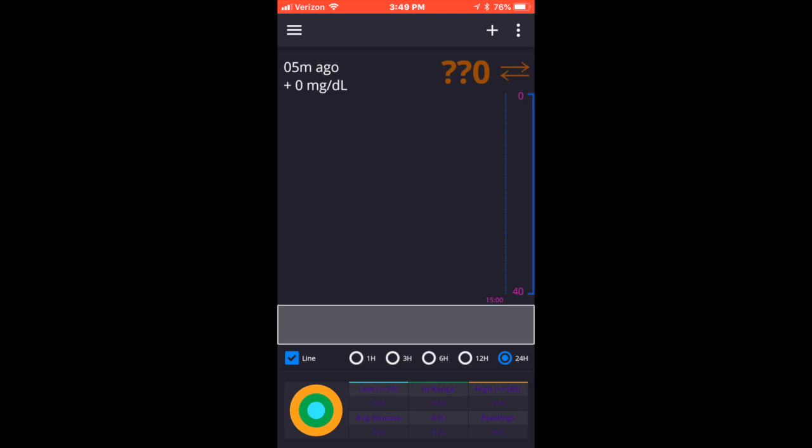Everybody's been asking how to connect the NightRider to the Spike app. You click on the upper left-hand corner of your app — and we'll see that happen here in a second. I'm sorry, I'm new at doing this. Bear with me. You click on the upper left-hand corner of your Spike app and you'll physically see the section where you're able to start the process for your NightRider.